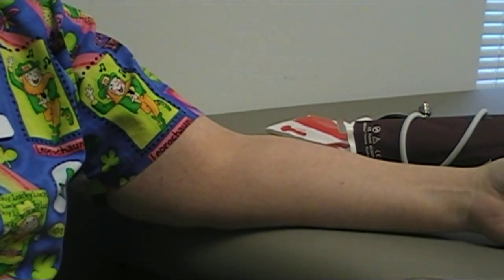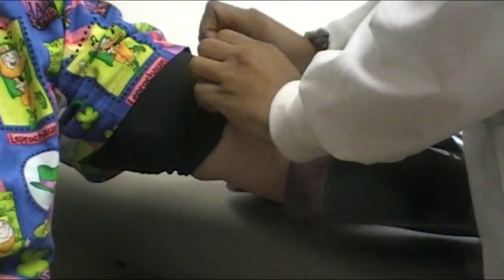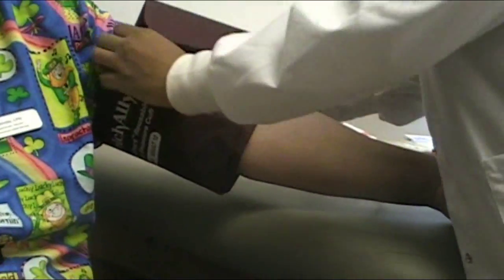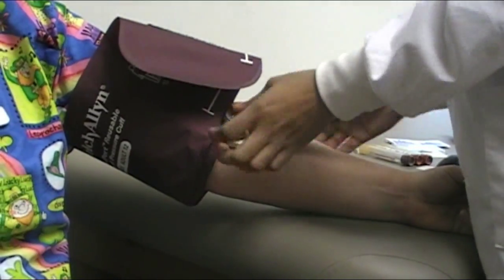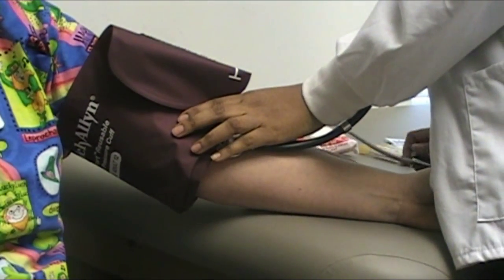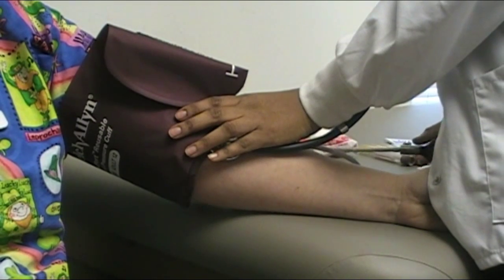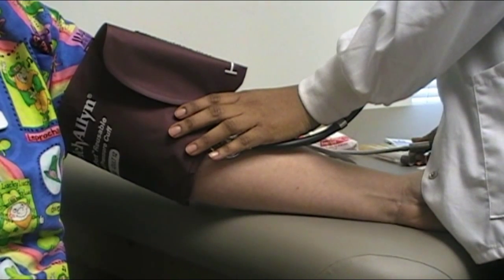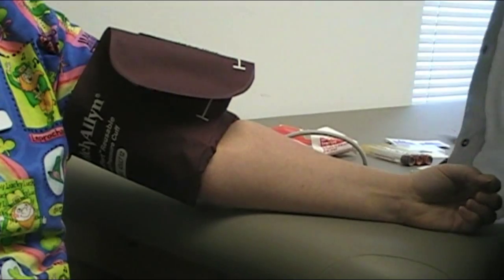Okay, so let's go ahead and take Miss Renata's blood pressure. What's your usual pressure? Depends on the day. It can be 180 over 100, or it can be 140 over 80, or it can be 110 over 60. 118 over 76. Is that good?